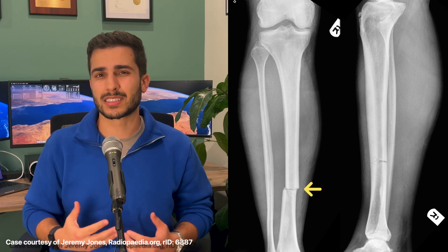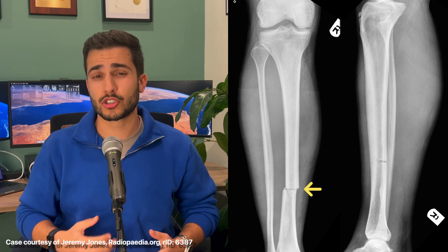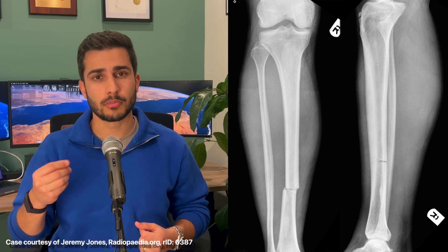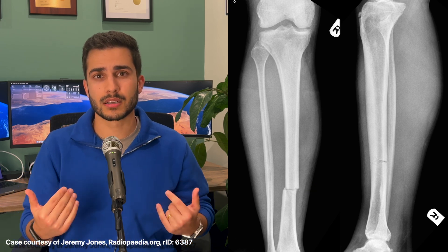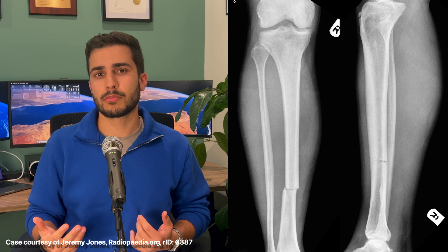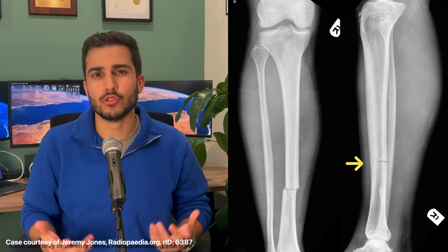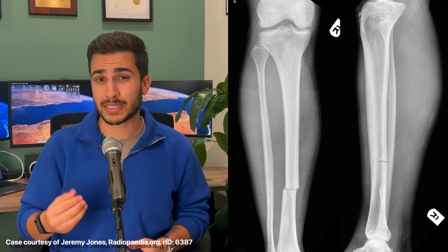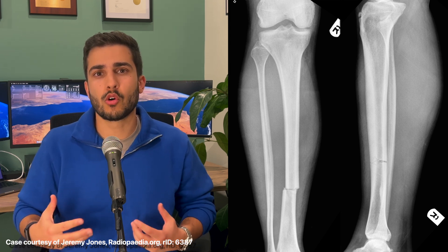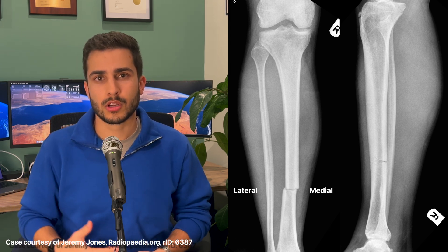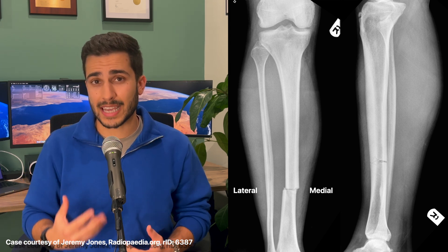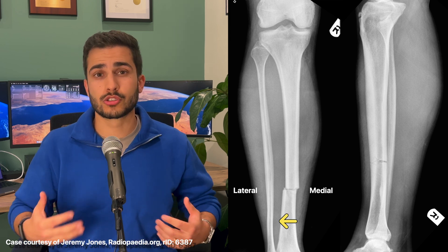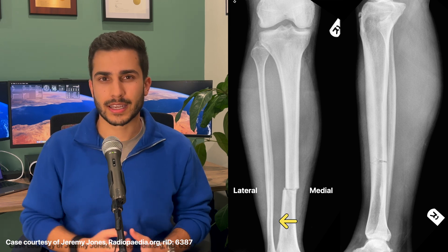In this case it's actually minimally displaced, which you can tell by looking at the AP. It's not displaced anteriorly or posteriorly — meaning either front or back — because looking at the lateral it hasn't really moved and is quite in line. The tibia is always medial with respect to the fibula, and on the AP you can see it's actually going towards the fibula, which is towards the lateral or outer side of the leg.